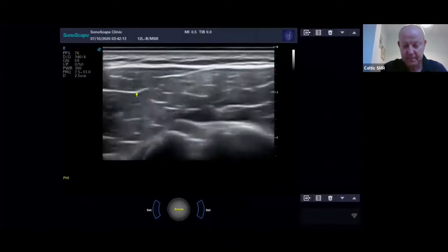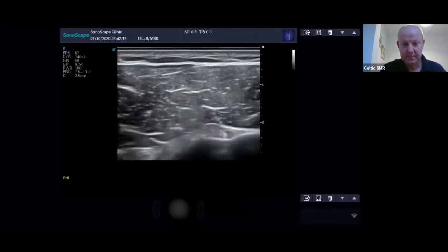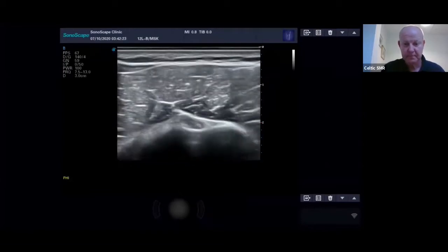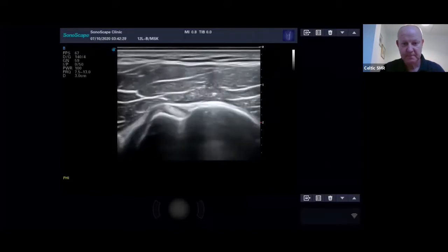Okay. Are you showing how you do a full general shoulder exam? Yeah. So you're going to start AC first? And then I start AC first. You don't have to. There's no rule about that. You start where you want, but once you get into a routine, you just tend to stick with it.